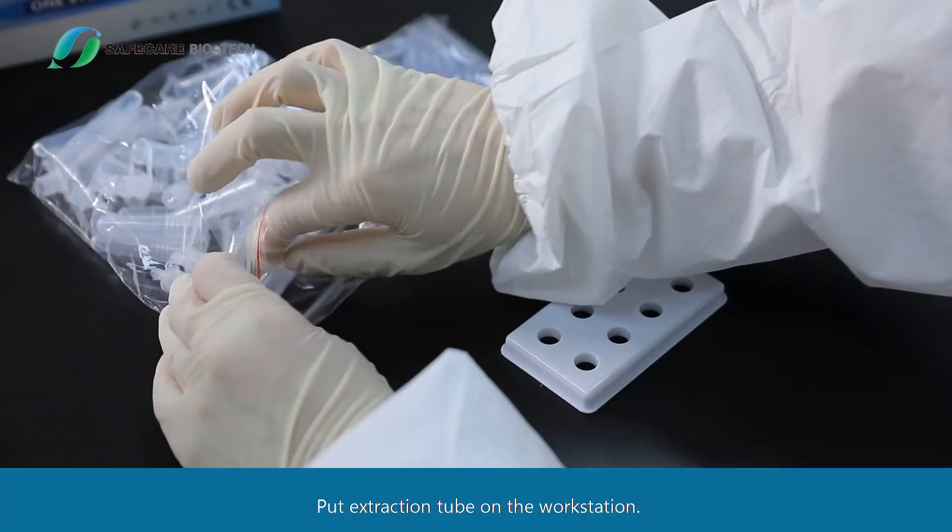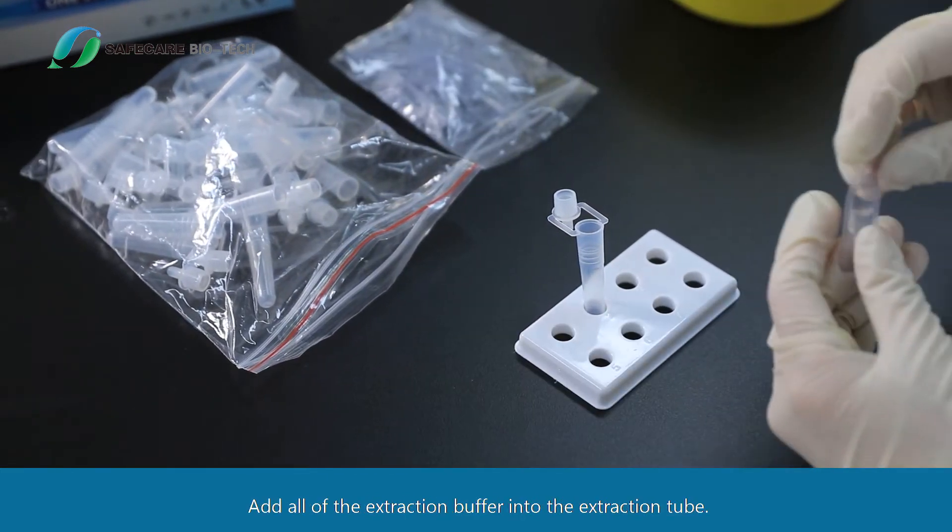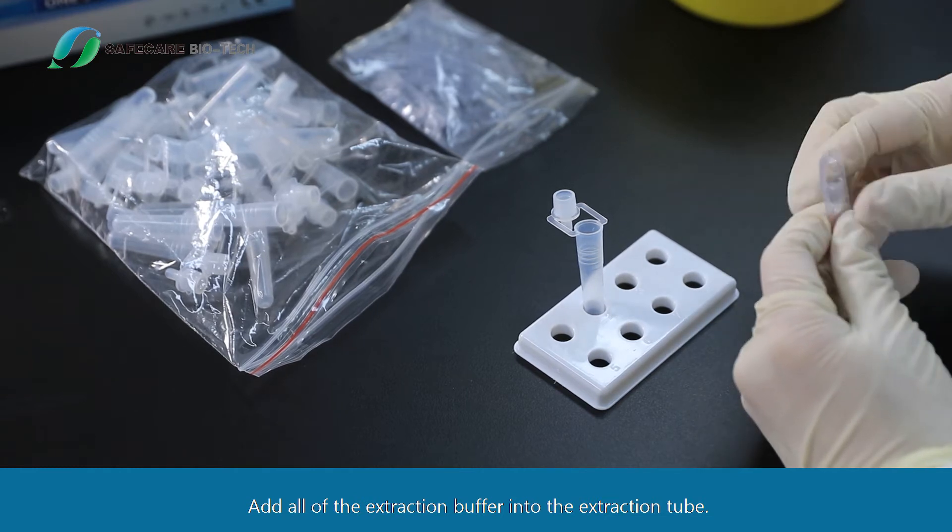Test Procedure: Put the extraction tube on the workstation, unscrew the lid of an extraction reagent, and add all of the extraction buffer into the extraction tube.